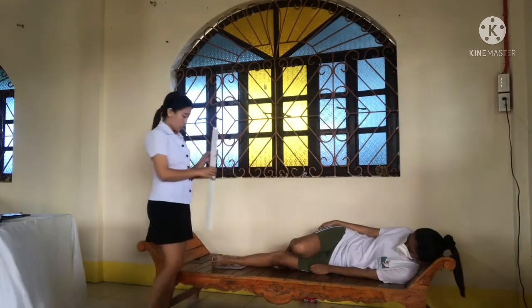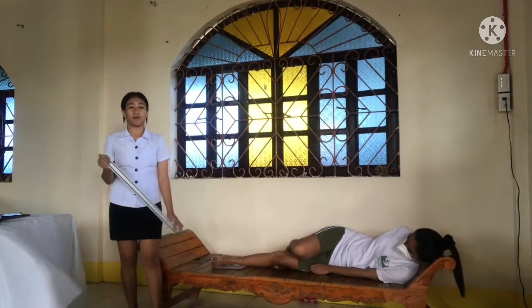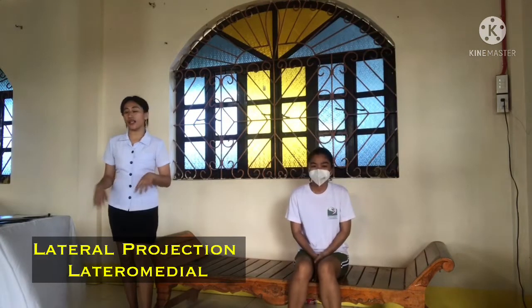So the central ray for this projection is perpendicular to the ankle joint, entering the medial malleolus. So this shows a true lateral projection of the lower third of the tibia and fibula, the ankle joint, and the tarsals. So next, the lateral projection of the ankle lateromedial.